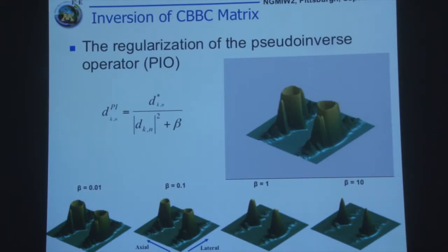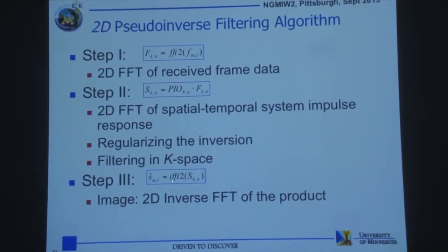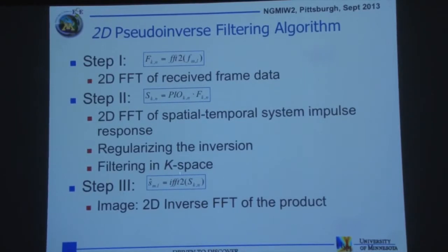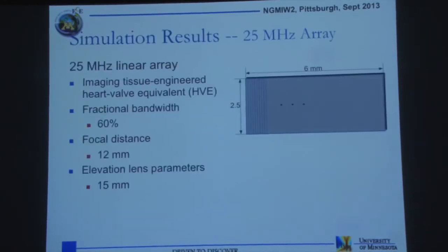So this was a very satisfying result, in the sense that we took what would have been an unsolvable problem into the domain of the Fourier transform, with regularization that worked really quite well, or is well behaved. This was done through a pseudo-inverse operator that allowed us to solve it. I'm sorry for this. Let me just move on because I'm taking some time.